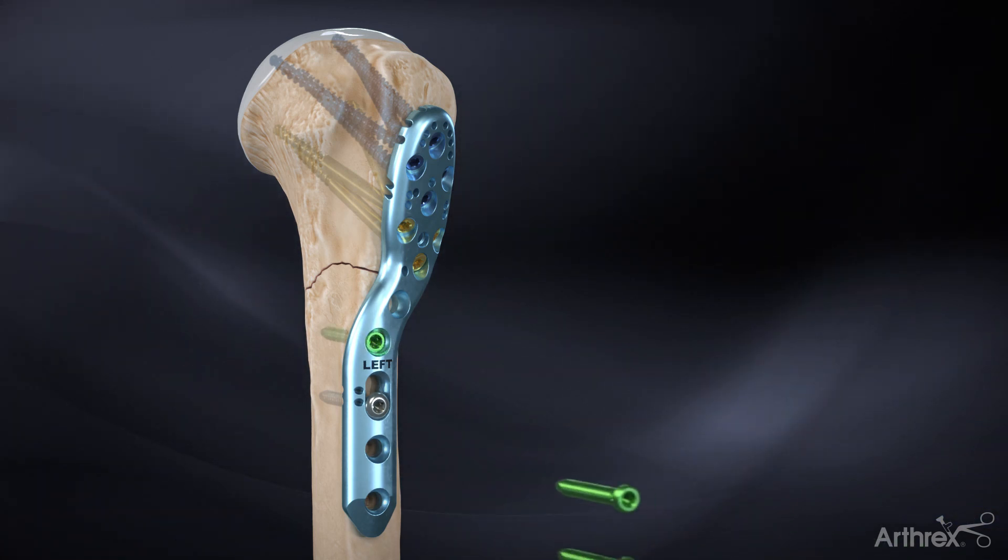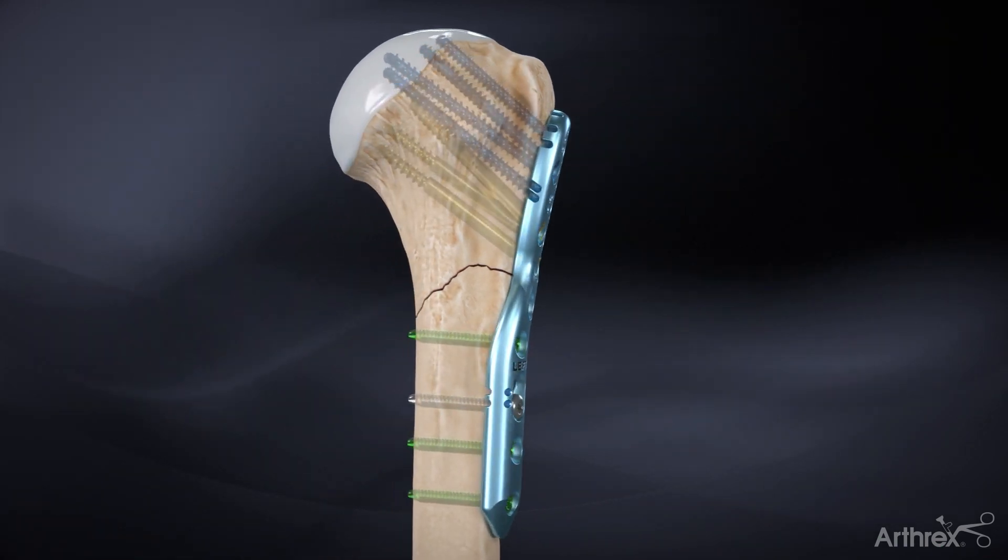Repeat the previous steps to fill the remaining holes with 3.5 millimeter screws to complete the plate fixation.